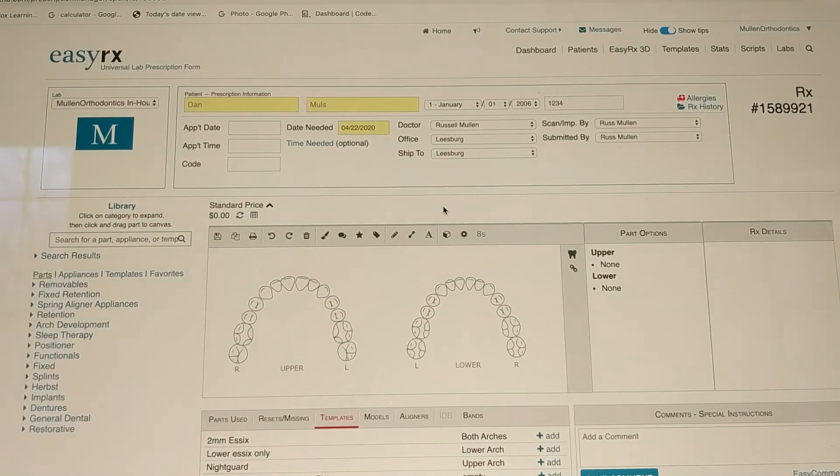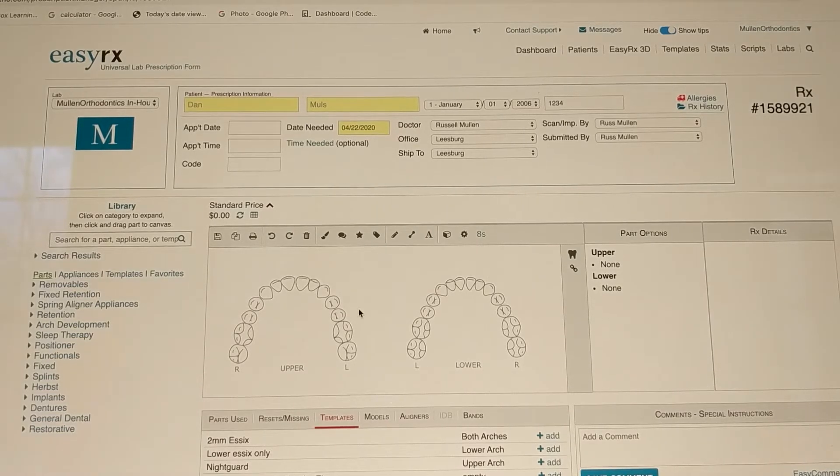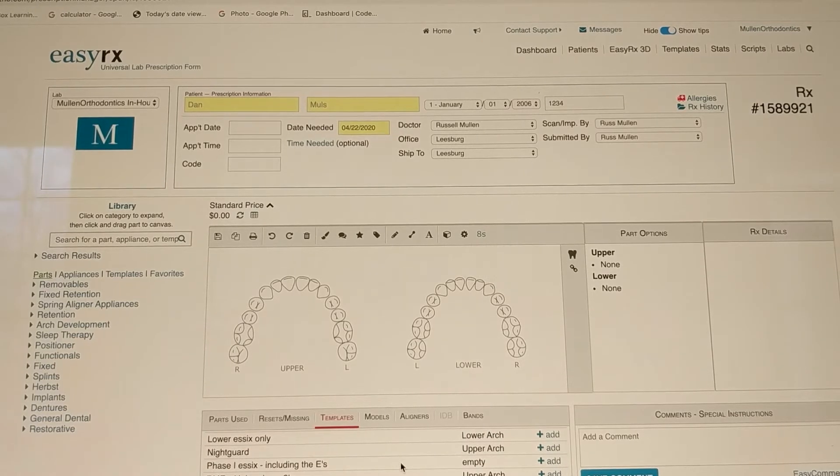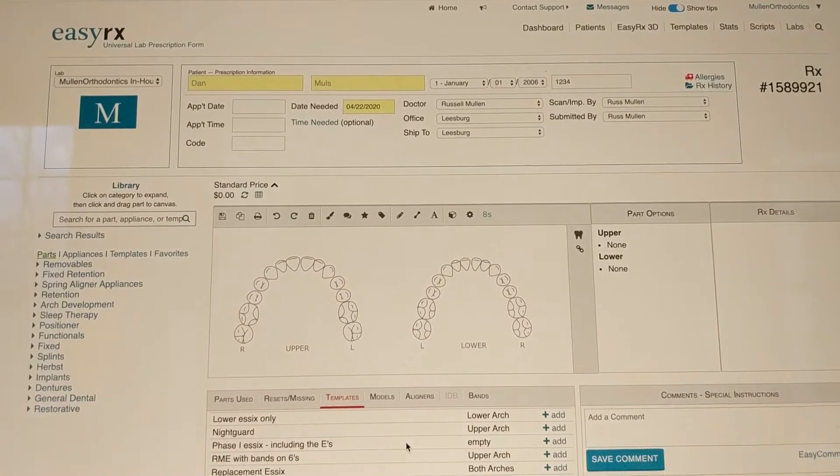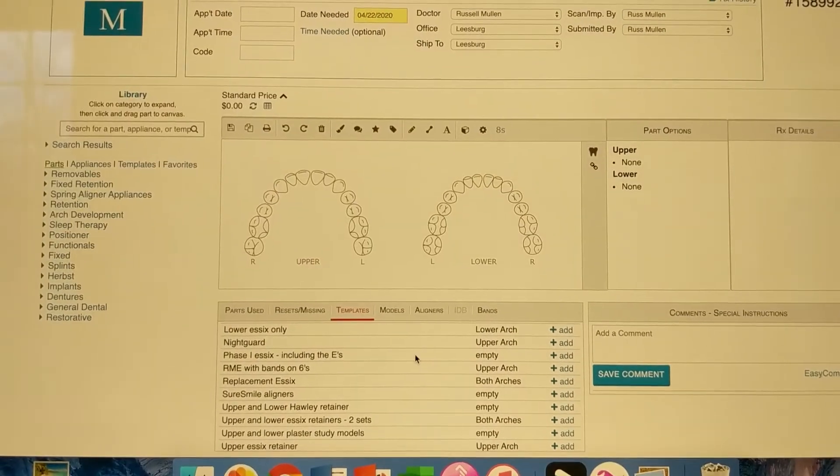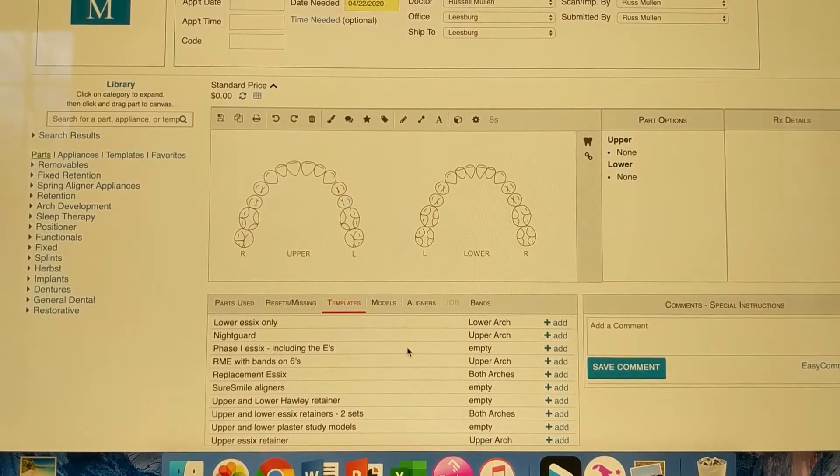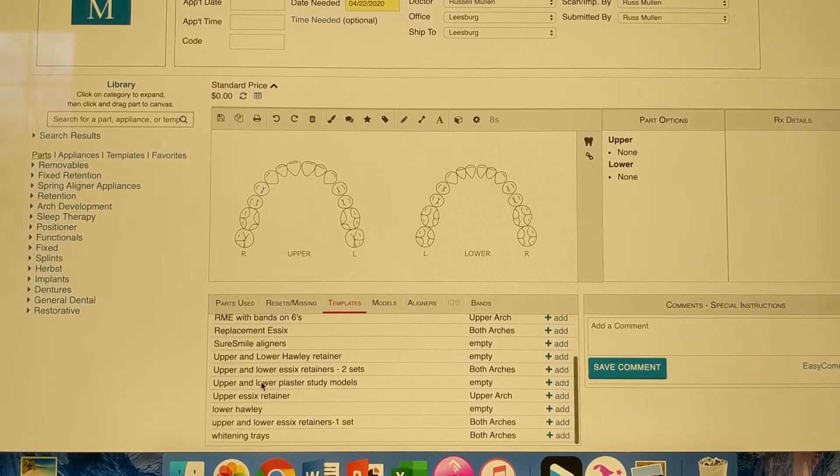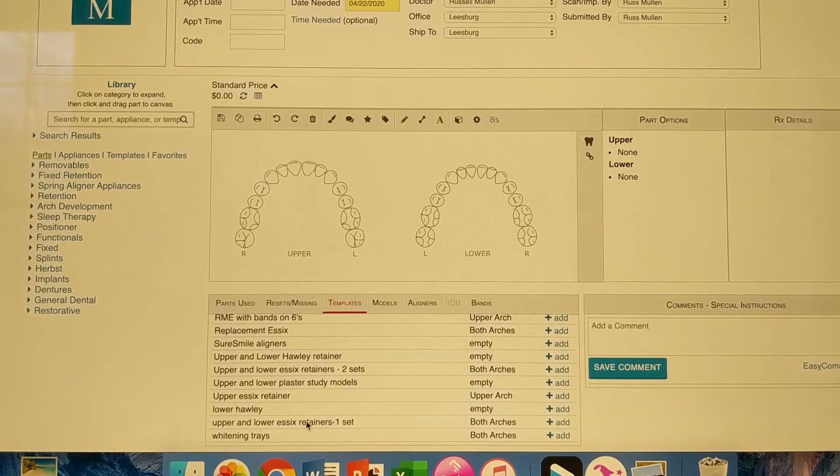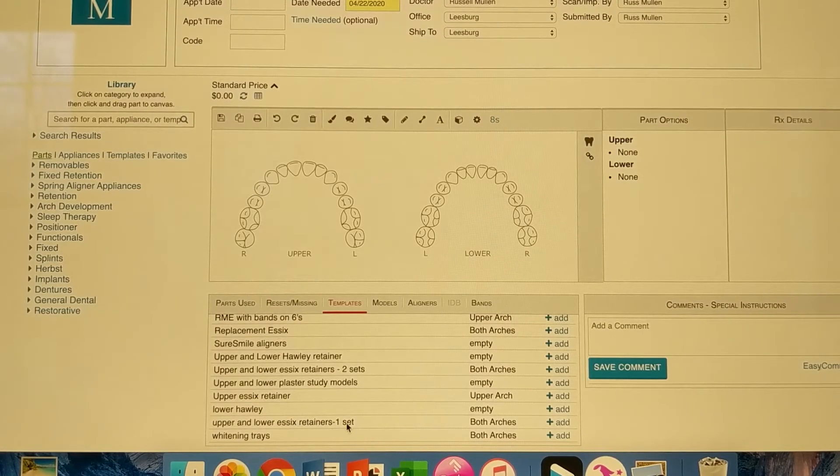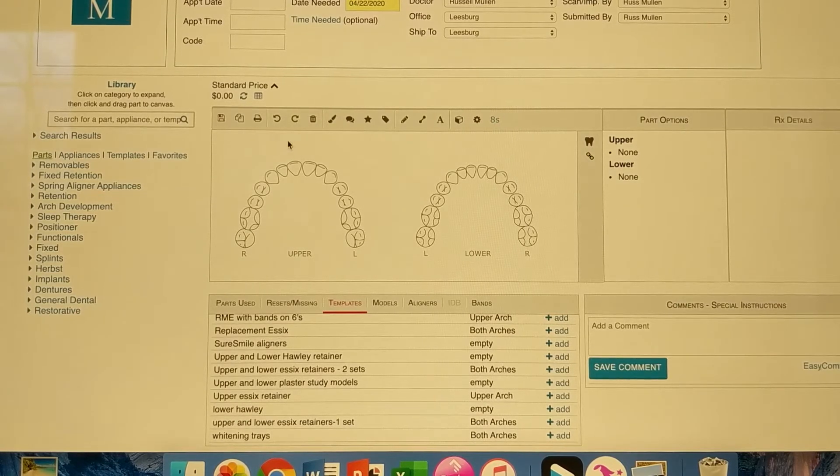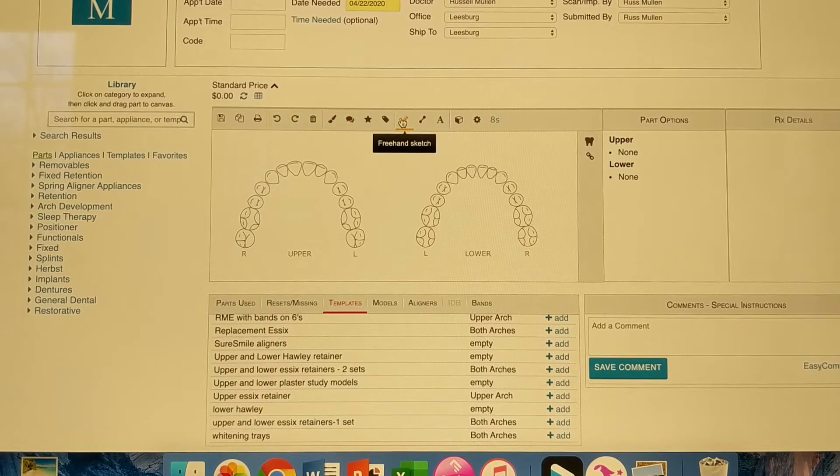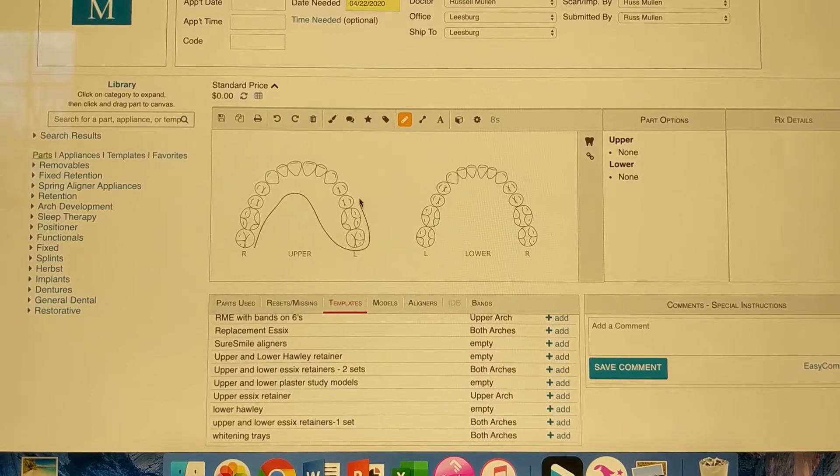And this little digital template comes up. They have, we have several, several templates, and you can make them, save them however you like. So we're going to do, let's do upper and lower Essex retainers, one set. So you can either draw on here if you want. So I'm just doing a freehand sketch.